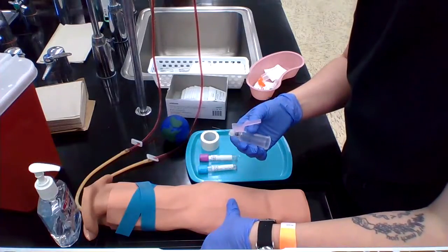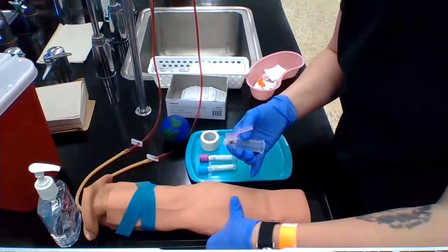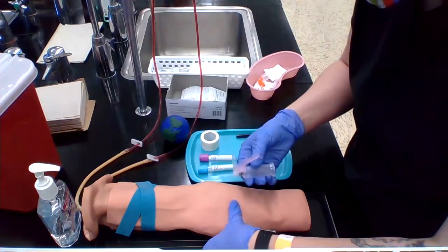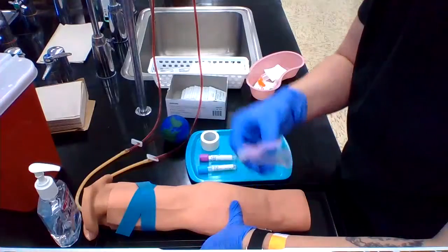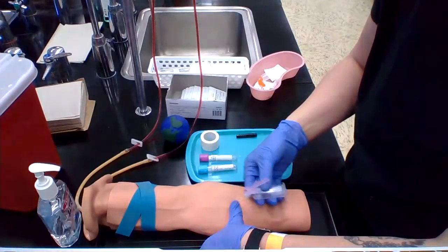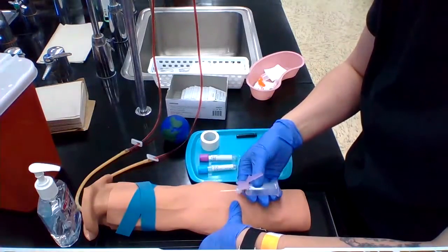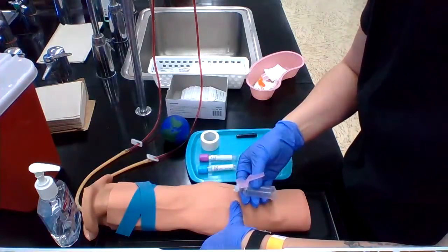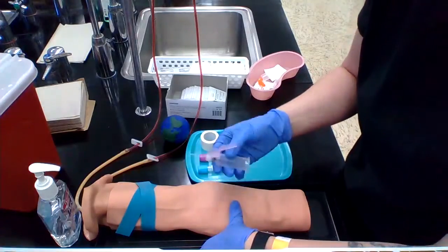When you anchor your vein, you want to go about an inch or so below your site. Press down and pull back — down and back — because that's going to stop your vein from rolling and can straighten it out. When you hold your needle, make sure the bevel is pointing upwards, and you're going to go in at an angle of 30 degrees. A good rule of thumb is to be flat enough so you're not going right past the vein, but not too flat so that you're just going into the dermis without reaching the vein.